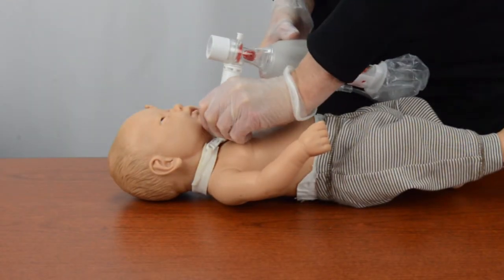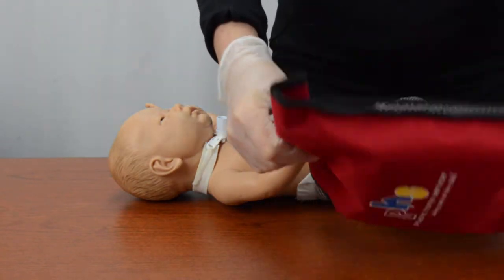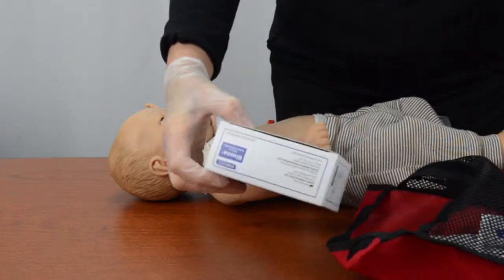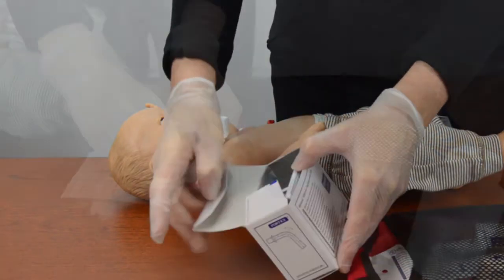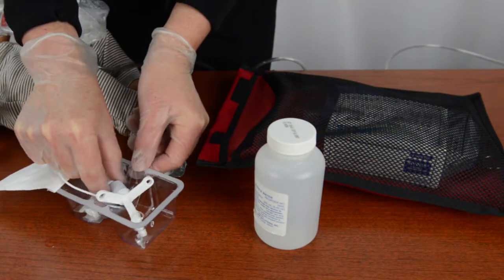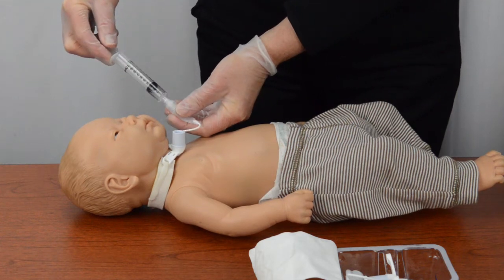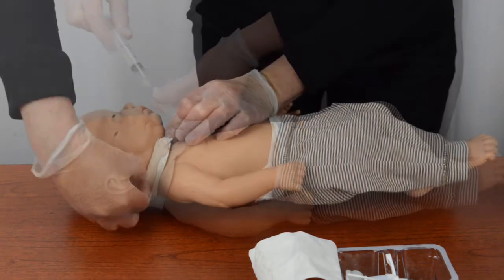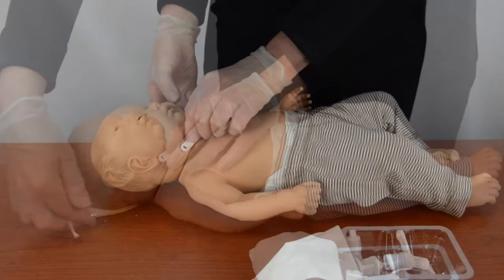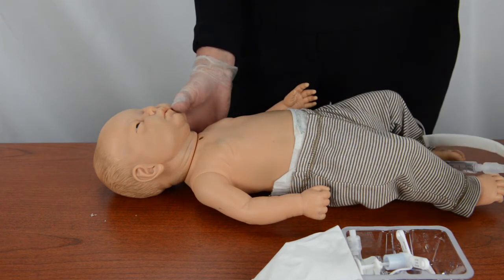If you do not see the chest rise when you squeeze the bag, perform an emergency trach tube change. Start by quickly opening the bag that contains the emergency trach tubes and supplies. Lubricate if necessary and if time allows. Deflate the cuff if the patient has a cuffed trach tube. Remove the trach ties from the trach tube. Remove the existing tube by pulling it out with a motion that follows the curve of the tube.